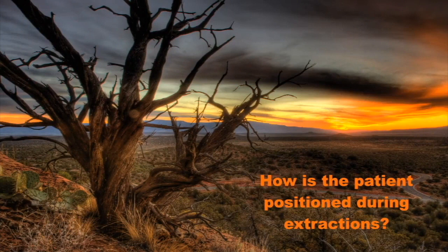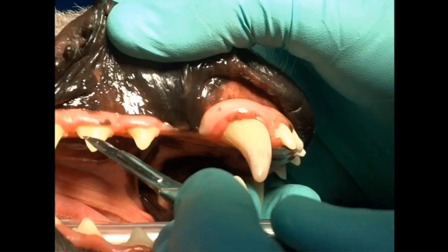Let's move to how the patient is positioned. We want maximum visual exposure to the patient, and we want to be able to place our luxator or elevator to progress to the apex down the groove we create around, say, a mandibular canine tooth. We want to use that instrument in a forward motion from our body to the patient's body. We don't want to come from up to down — we want to come from us to the patient so we can apply a little forward force.